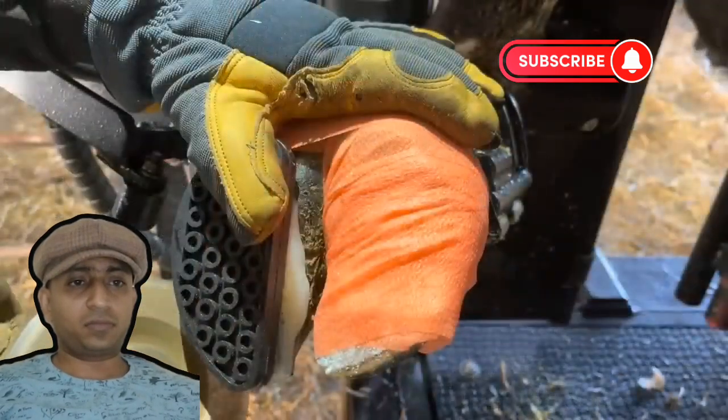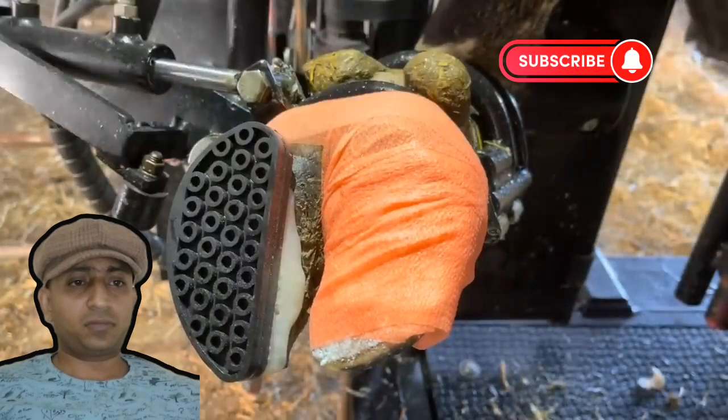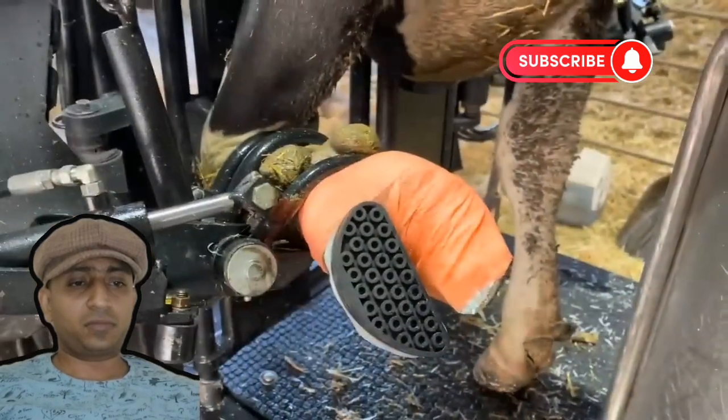Now that we've got this wrapped up, we'll just clean up this excess glue with our grinder. We'll put this foot down and see how she likes standing on it now.